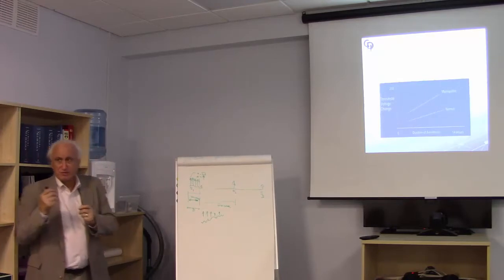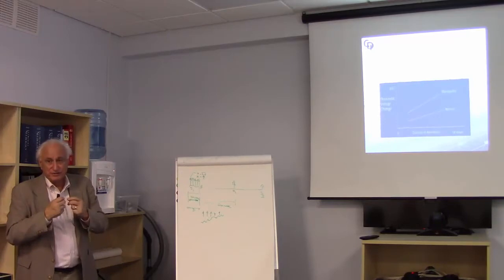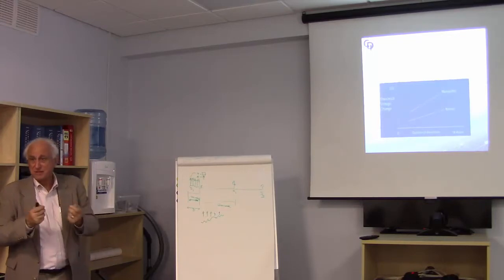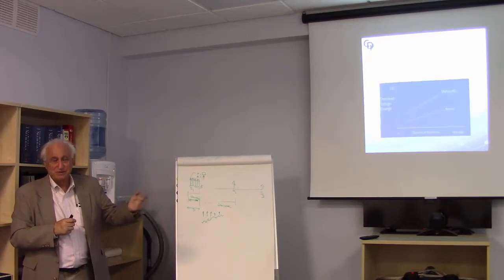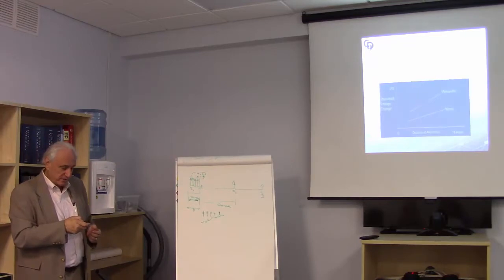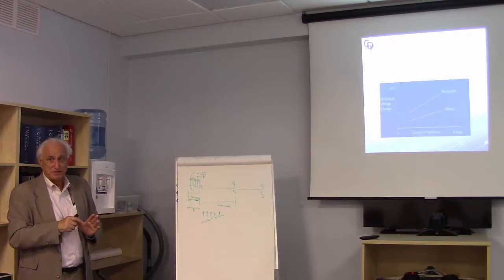But as I mentioned earlier, I don't like to adjust intensities to compensate for decreasing amplitude because it may mask what we're interested in. In fact, it could be producing an injury and you're masking it because you think you're dealing with the anesthetic phase. So we're very, very slow to adjust because of this anesthetic issue.